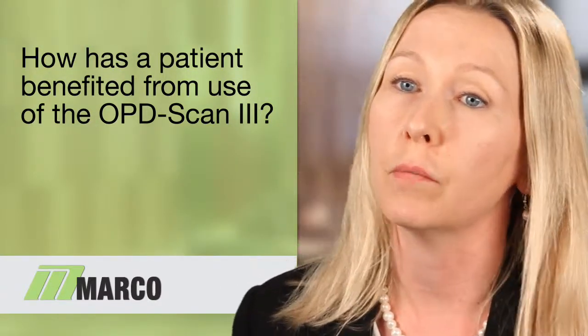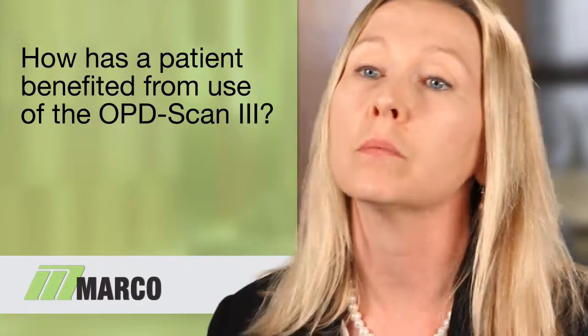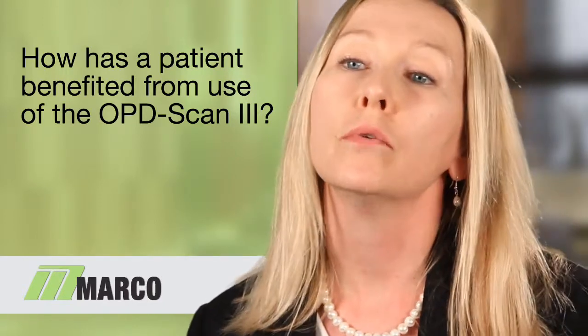In a few weeks, those aberrations increased, and indeed we then knew that the aberrations were coming from the posterior capsular fibrosis and not from the lens. And we were able to reassure the patient and explain to him that with a simple laser procedure, we will be able to help improve his visual outcome and he does not need to worry about possibly explanting the implant.